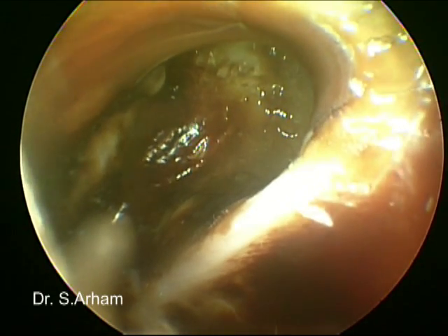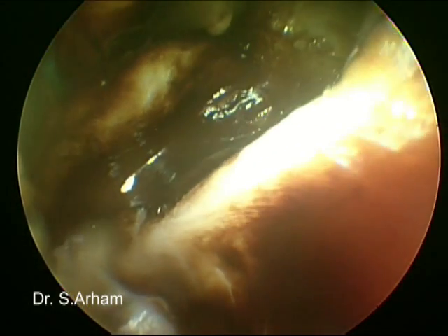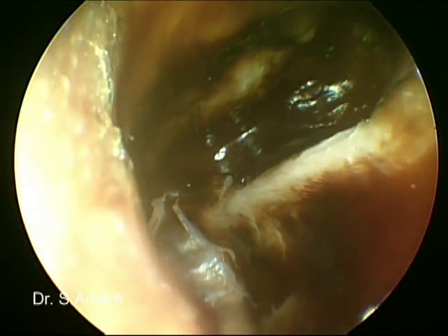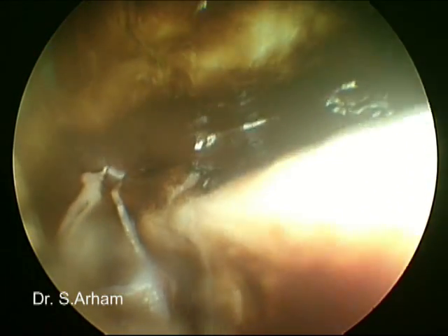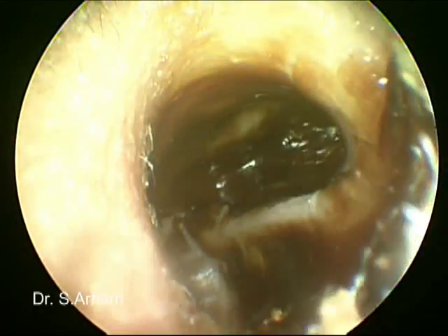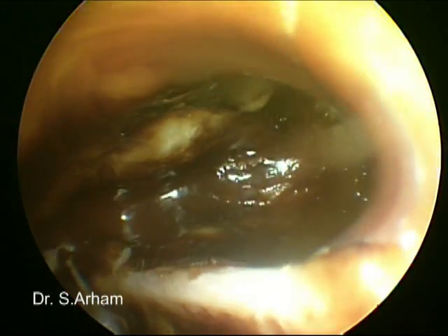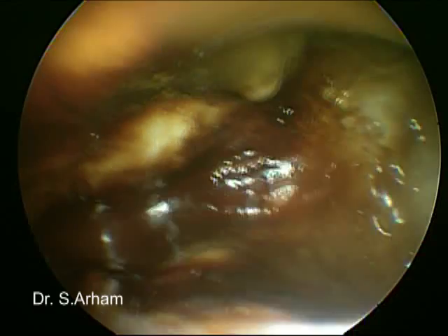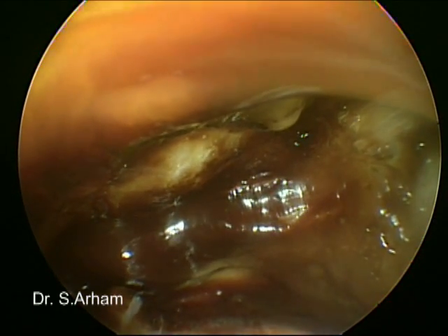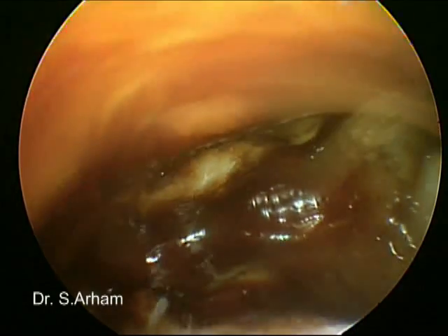You can see after two months of surgery, you can see the cavity. There is a nicely epithelialized cavity. Even in the canal, you can see some formation of wax. In these cases, it is very important to follow up with the same set of special instruments where you have to do the cleaning of the mastoid cavity.